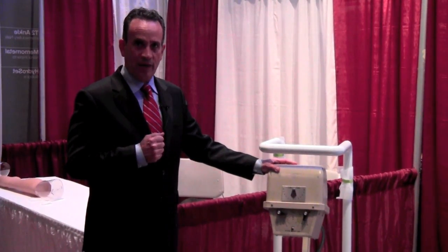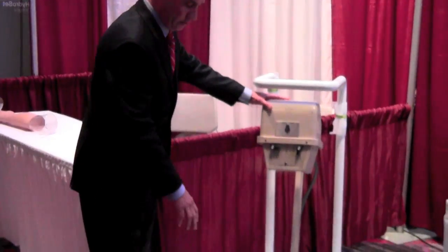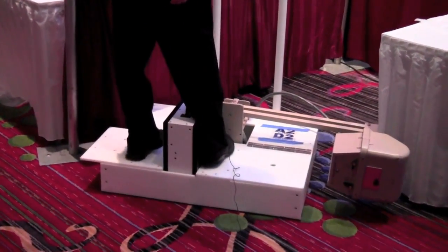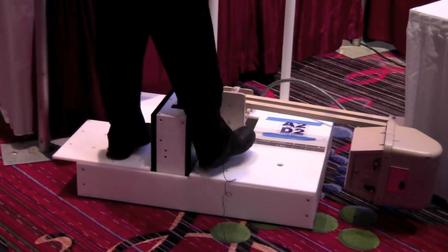I'm going to demonstrate three primary shots on this system. The first is a lateral shot. You can see I have the imager up in the vertical position. We rotate the head down, stand up over here, pull the trigger on the Excel system, and it starts processing the image.